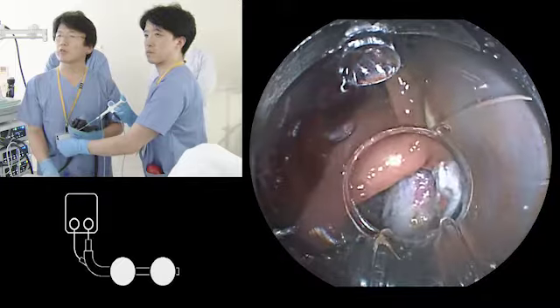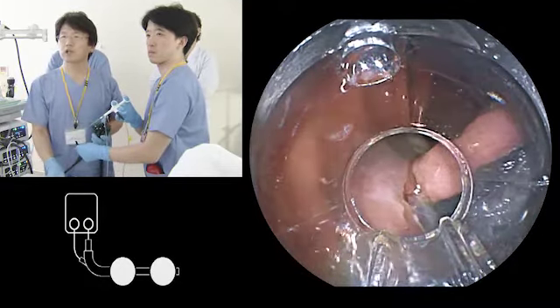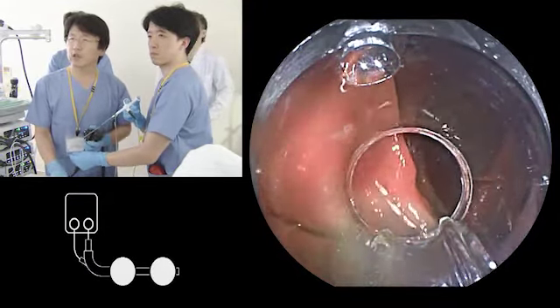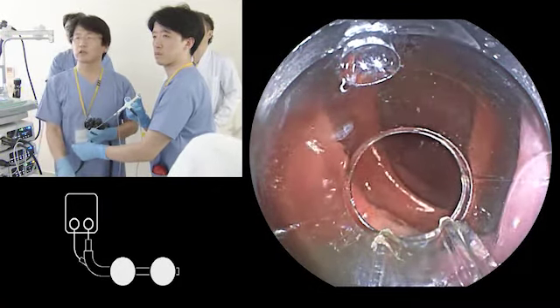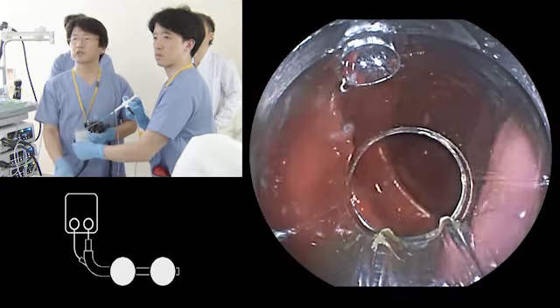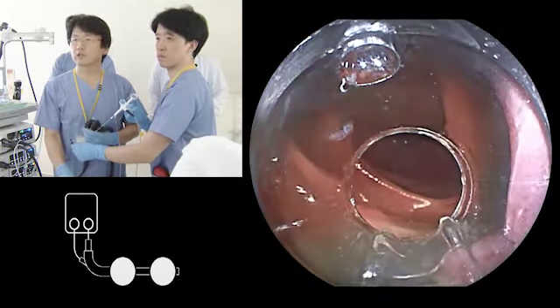So I will open a little bit of this mucosa, and then open the pocket. But I will start opening the pocket from this side, because the water is here. So even if I cut this side, the lesion hangs down, and it keeps good condition. But if I cut this side first, then everything falls down and makes the procedure difficult. We can change the patient's position, but in this position, I think it's better to cut here first.